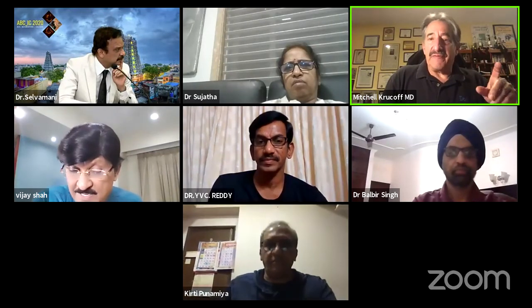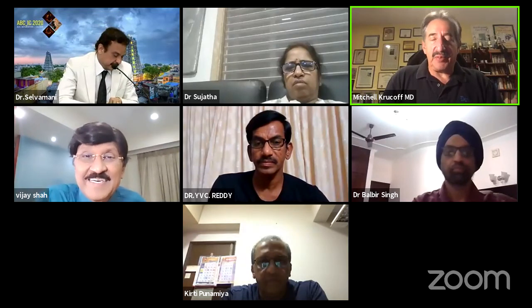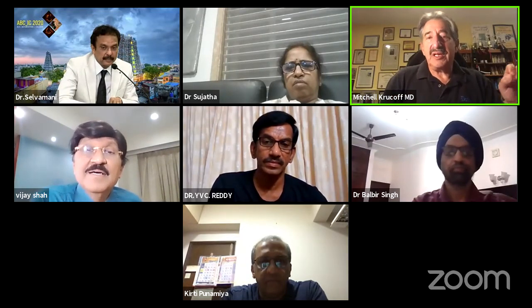So I'll go backwards and you can remind me if I forget, but the slow flow, I think definitely is yes. There's less slow flow, and for several reasons. One, part of the technique, it's ironic. I'm an old guy, so I go back to when rotablator first came forward. One of the key teaching principles that Maurice Bookbinder did in the early instruction courses was to emphasize going slowly.